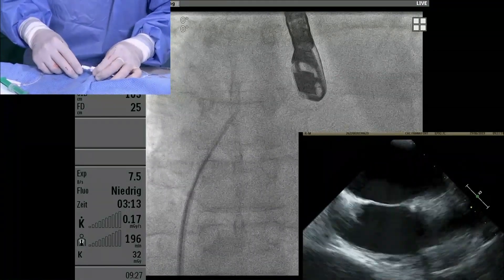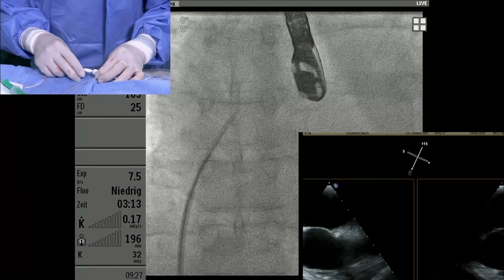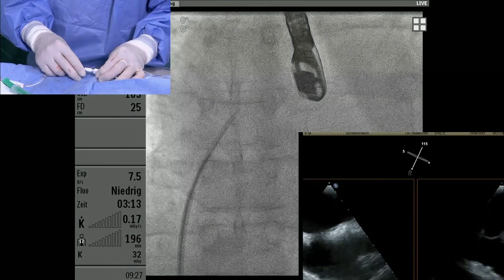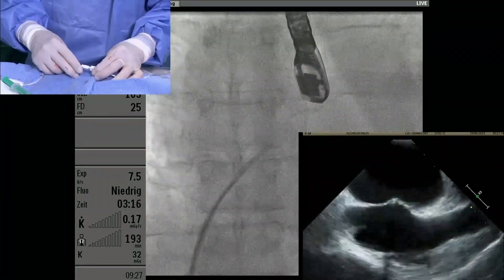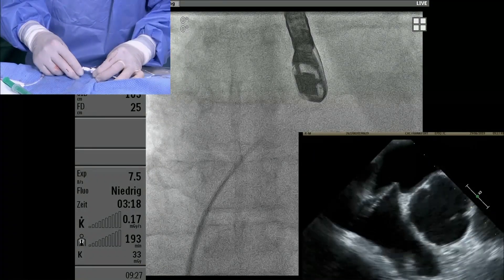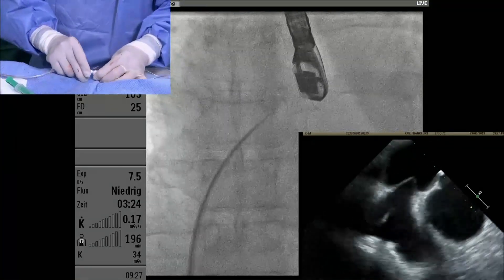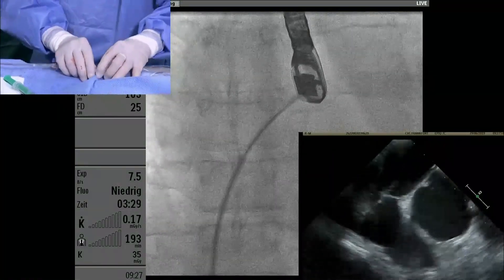Can you confirm I'm in the middle of the septum? The camera has to focus on the echo screen. You can go back and forth, stay in the long axis. Nicely in the mid part here. I'm through. I'm advancing the dilator, I'm advancing the sheath.